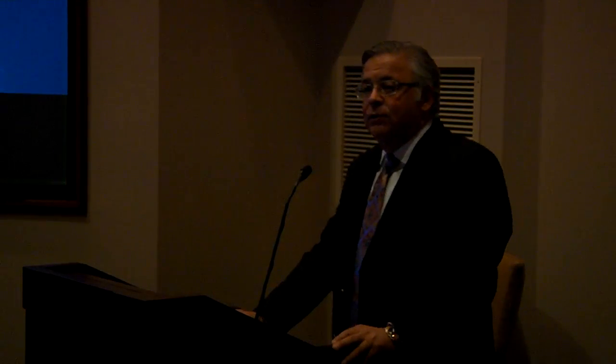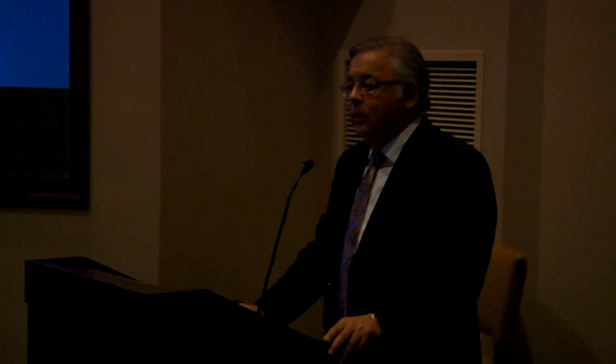To that end, you've probably heard of diffusion-weighted imaging. I'm going to talk a little bit about magnetic resonance. Maybe you've seen this in your reports. I know that if you take care of patients in the setting of stroke or neurological disease, diffusion imaging has been present for many years and is used every single day. We've begun doing this over the past 2 to 3 years after Dr. Salty started his service here at Edward Hospital, and it has added something, I think, to the workup of some patients.